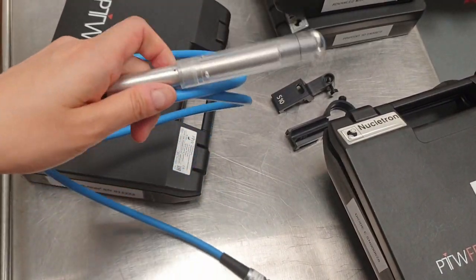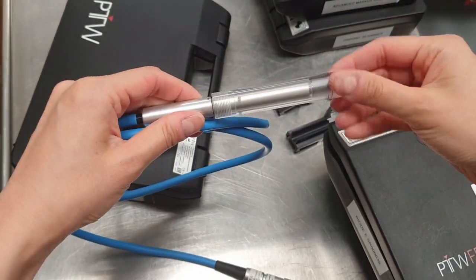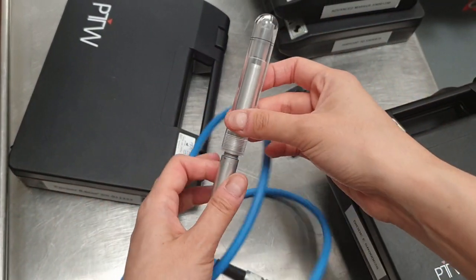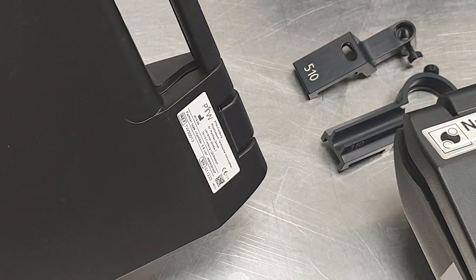This is our stock standard cylindrical waterproof Farmer ionization chamber. We've had this detector for a while now, and for those of you who are curious, this is the PTW 30013 type.